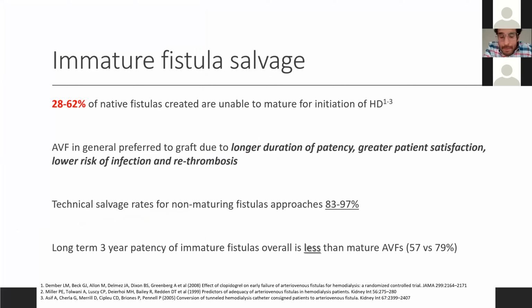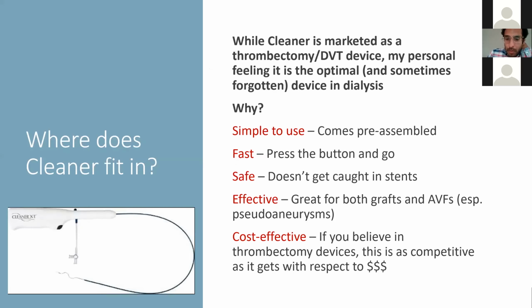Oz? Yeah. We do have a question, and the question states, what is the risk of showering pulmonary emboli with Cleaner? As you know, we do have the indication that if it's utilized for DVTs, it is recommended that an IVC filter be placed. But what about in the AV graft and fistula arena?